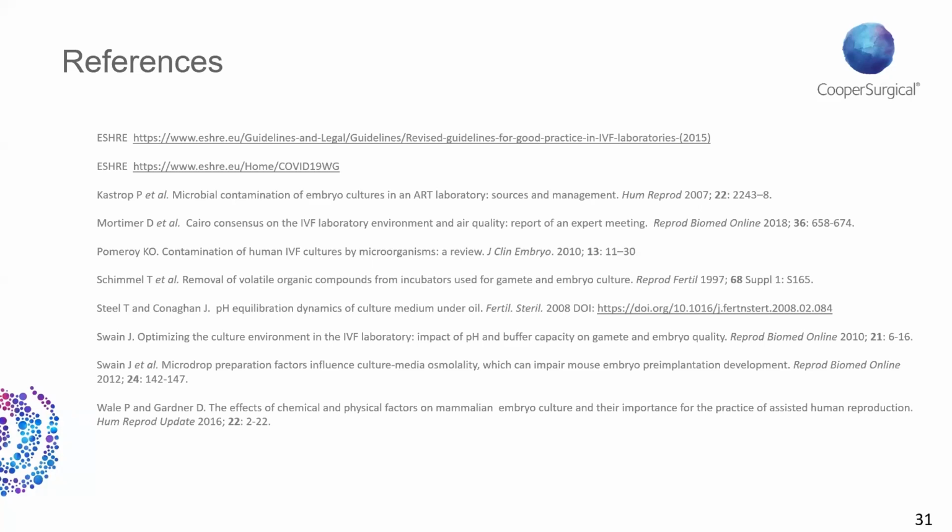So the general advice is 24 hours for off-gassing, depending on the type of dish that you use. As I mentioned, some do have a porous part to the packaging, which allows off-gassing while they're in transit. And of course, in that scenario, they need much less time. And remember, of course, as soon as you take your dish and put it into an incubator at 37 degrees, it will produce and release excess VOCs if you haven't fully off-gassed.